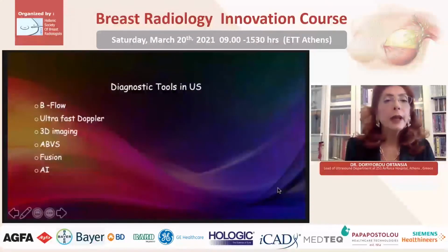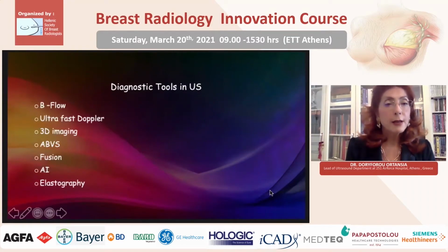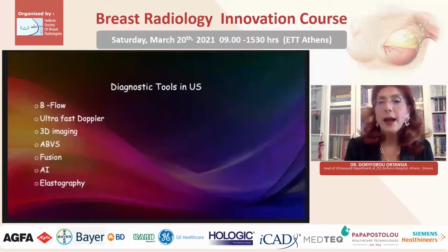Artificial intelligence, again, can be implemented in ultrasound, improving the daily routine workflow, initiating smart features such as auto-annotate, find orthogonal, etc. And last, elastography, strain and shear wave, which are based on physics, are very innovative techniques and have shown high sensitivity and specificity for characterizing lesions.